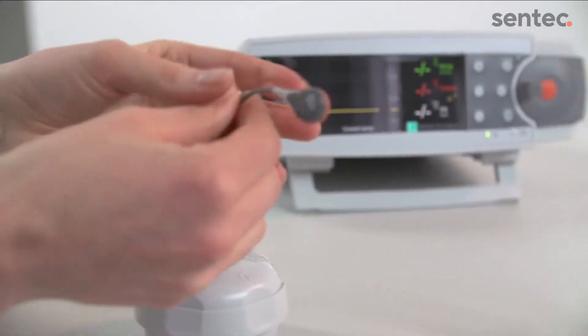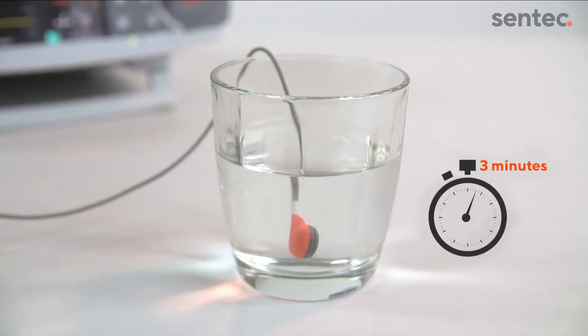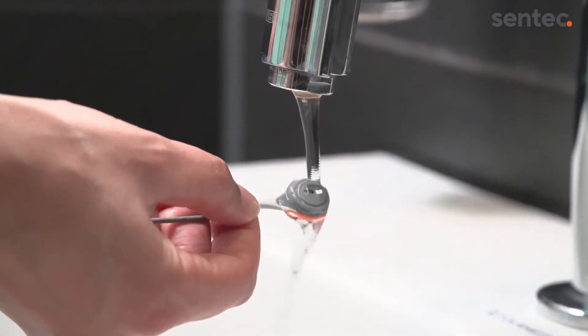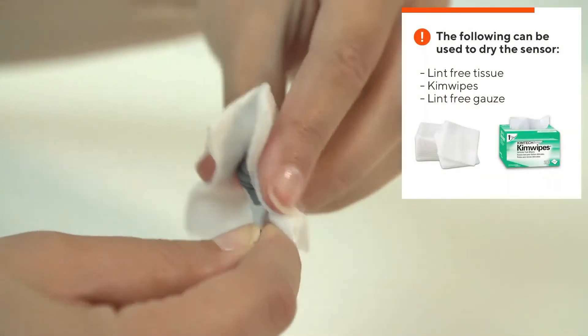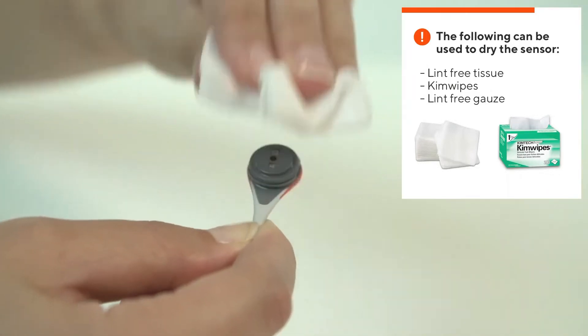Once the membrane is removed, immerse the sensor into clean room temperature water for 3 minutes. After the 3-minute soak, gently rinse the sensor with clean water. Dry the grooves around the sensor with clean, lint-free gauze and make sure there is no gel residue remaining in the grooves.